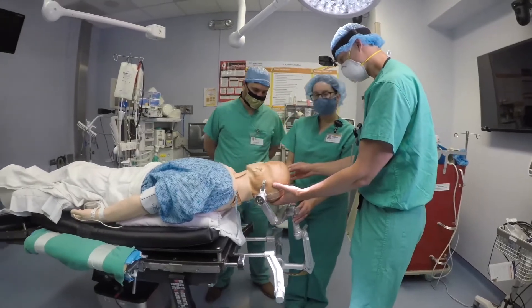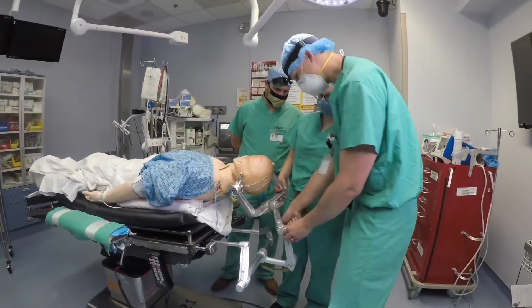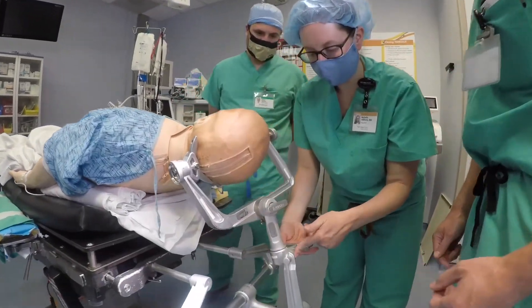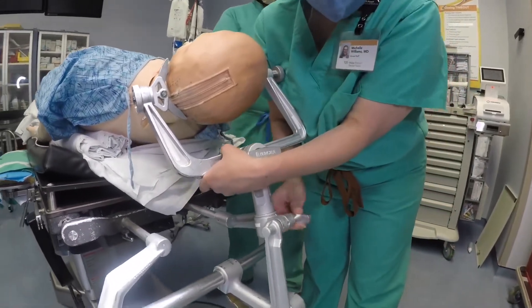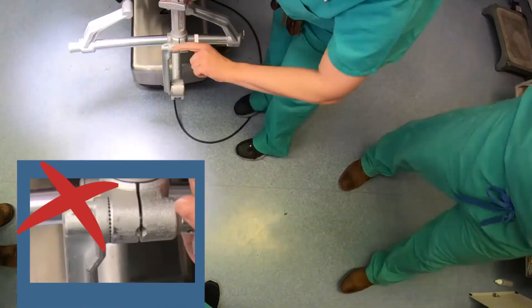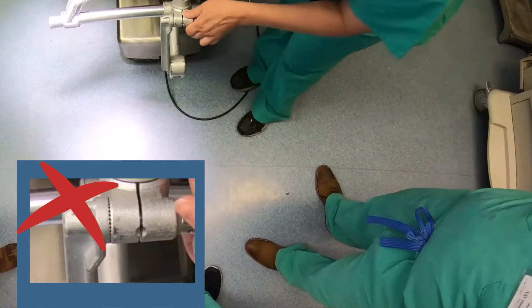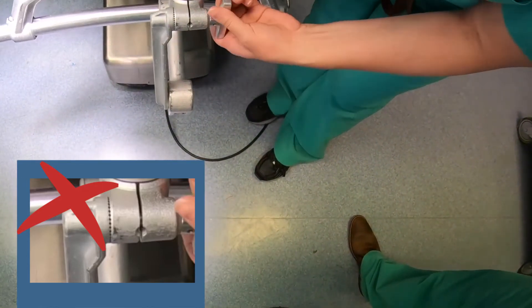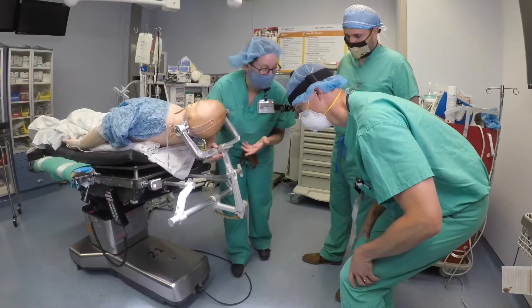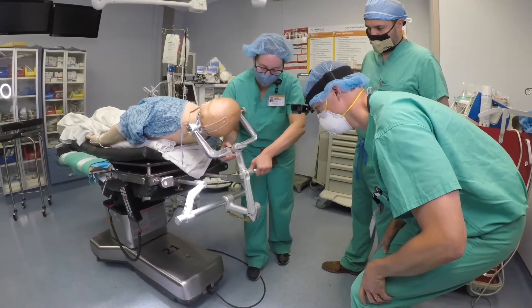We already discussed going to three dashes or 60 pounds of pressure. Another important point is getting the teeth correctly engaged. When screwing it in correctly, all the teeth will lock up nicely. If incorrectly engaged, it won't screw together correctly and you'll see gaps between the teeth. If that happens, just loosen it, wiggle it a little bit, and try again — let it lock into position.